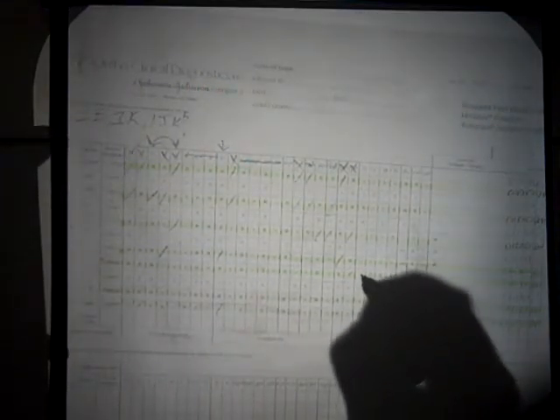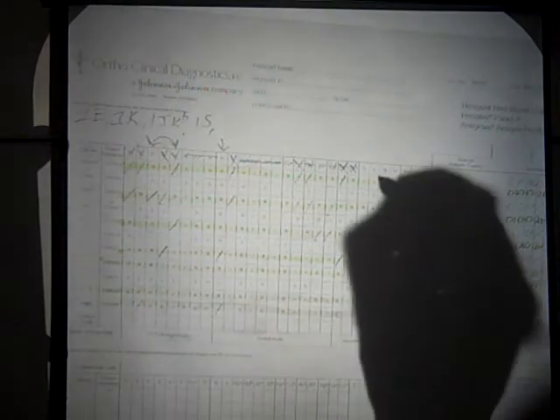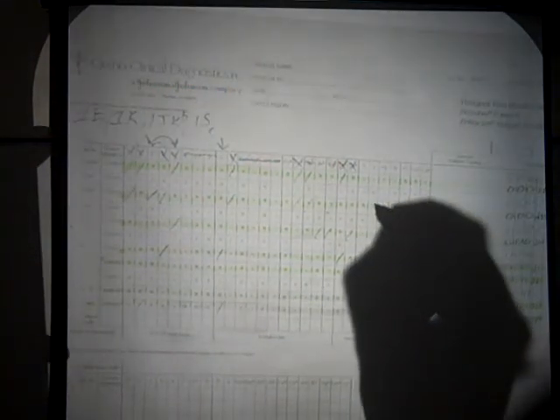Big S and little s are antithetical partners, and it looks like I only have one rule out on big S, so I need to find one more S. Little s, cell line number 3, and our last cell line, so I ruled out little s.